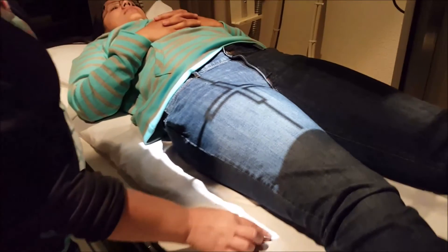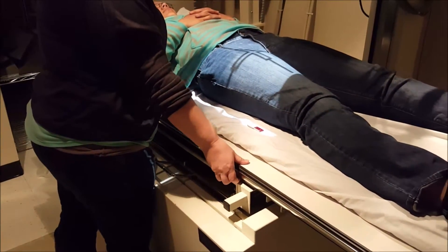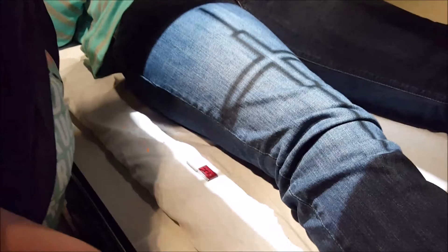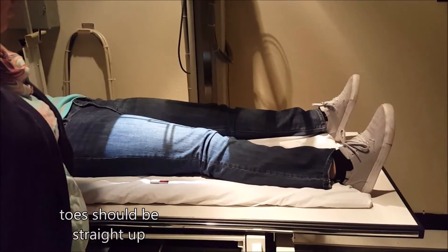For the distal femur, we're going to have a marker here also. I'm just going to move the patient up. We need to have the bottom of the IR about 2 inches below the knee joint, so that's about there. We are going to have overlap just because of the position of our marker. For this one, you're going to have the patient bring their foot back up so that the knee is in a true AP position.